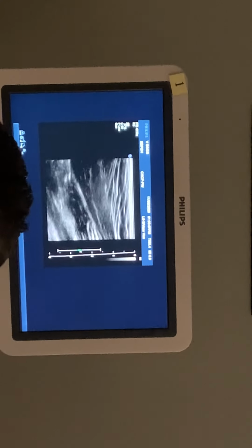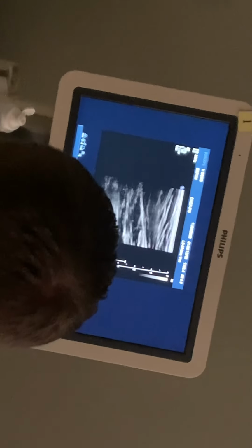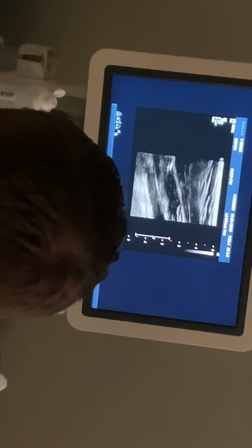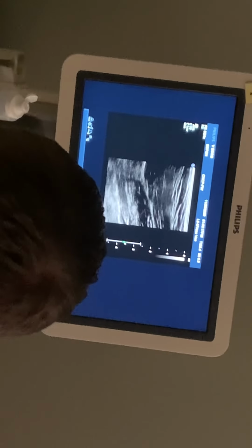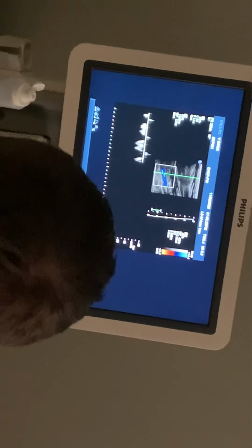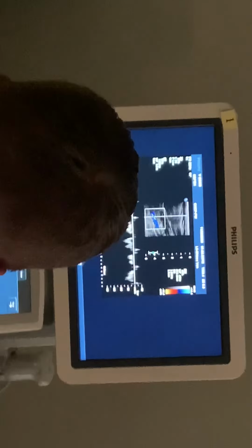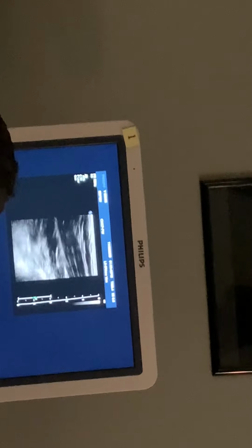And then distal, yes? I'm going to keep following that up. Increase our depth a little bit. And distal, yes? Now, what does it say on there? Usually they want a compression. A lot of places are going to want a compression at some point, yes? I usually like to do it at mid, and obviously we're going to do this in transverse, right?